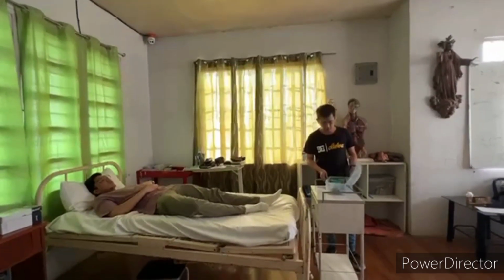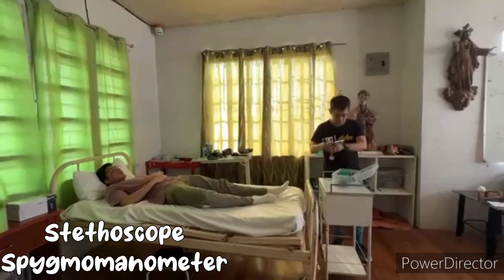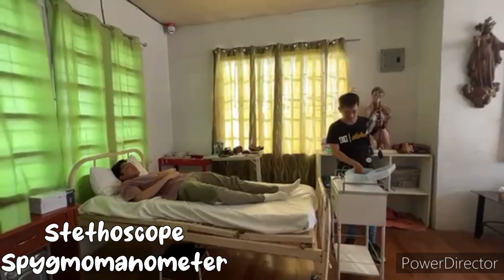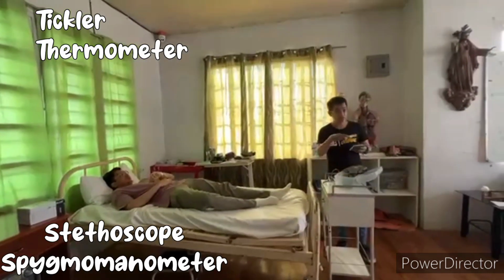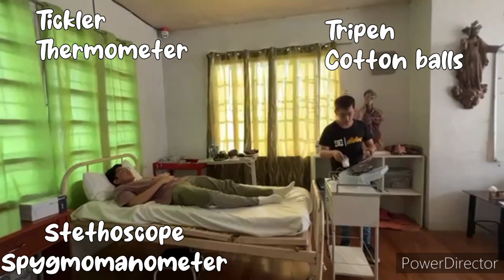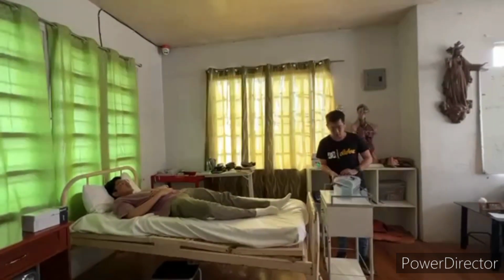And then you have to gather all the materials that you need, including the stethoscope, sphygmomanometer, tickler, thermometer, tri-pen, and the cotton ball soaked in alcohol. After gathering the materials, you may now go to the patient's unit.